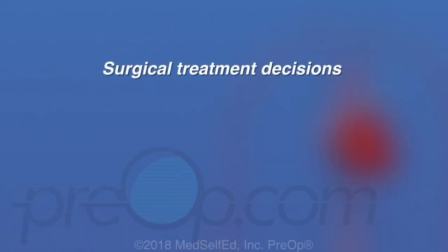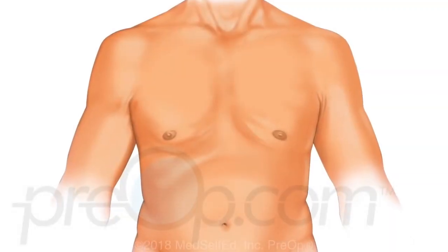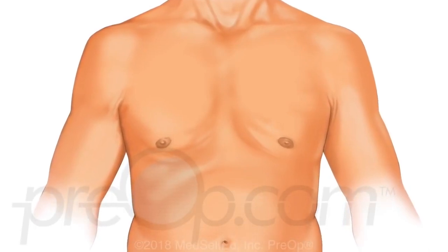Individual surgical treatment decisions depend on many factors, including the experience of the surgeon, how many arteries are involved, the location of the blockages, and their severity. Now let's look closer at the off-pump coronary artery bypass surgery.